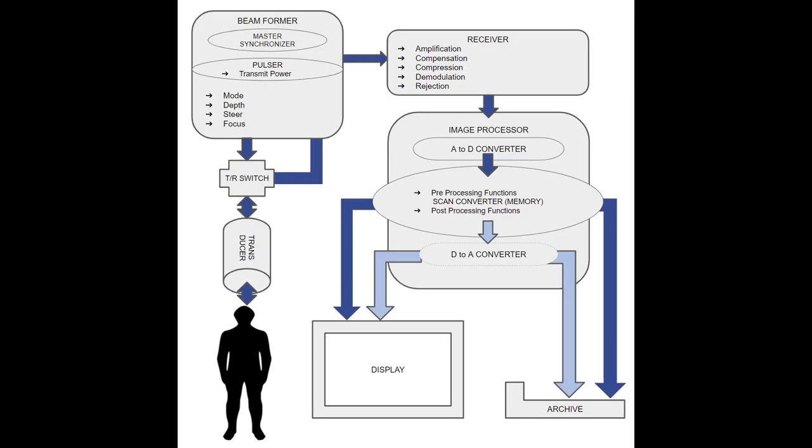Now the next page will show you a map of the ultrasound system and all of its components that we will discuss in this unit. Some of these topics will be discussed further in detail in their own units, and discussions surrounding modern technologies and more resolution will be discussed in a subsequent unit as well. So here is the map of our ultrasound system.